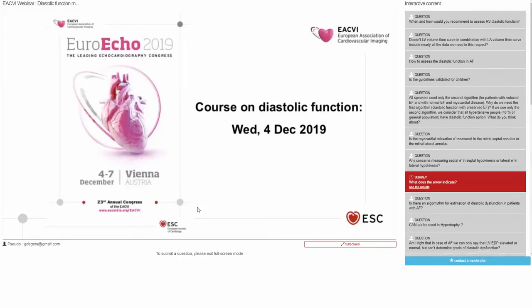We should call that normal, but I think they do also still have a higher chance of developing atrial fibrillation and problems. So it's a little tricky there. While we're trying to honor the age-related diastolic problem as relatively normal, that causes a problem for pediatric or younger patients because 8 centimeters per second or 7 centimeters per second may be age-related at 65, but that's abnormal for a 54-year-old or 20-year-old, and we end up calling them normal diastolic function. So we have to be a little bit careful of that.